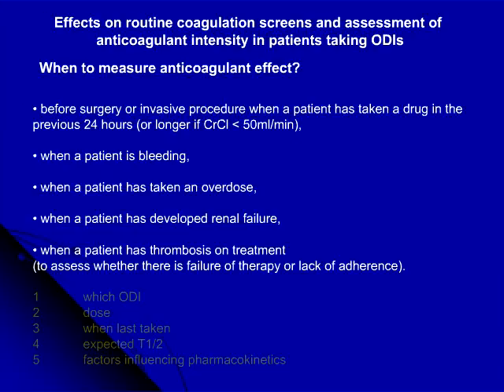Now, personally, I see that that's going to be a difficult problem. One of the advantages of the vitamin K antagonists, of course, is that the INR remains prolonged for quite a long time after the drug is stopped. So you can measure the INR maybe 48 hours or so after a thromboembolic event, and that will be a relatively good indication of the intensity of anticoagulation at the time, or the perceived time, of the event.